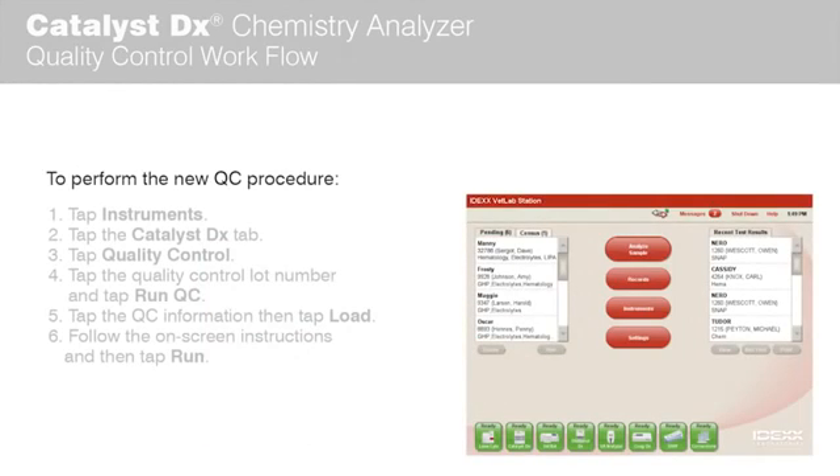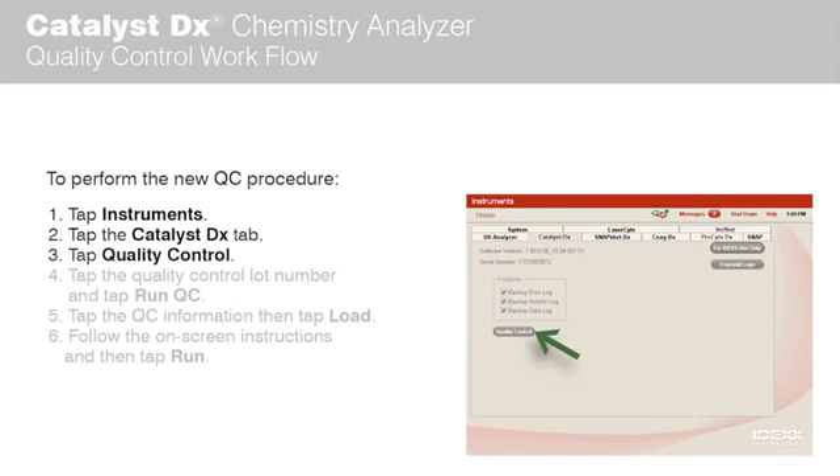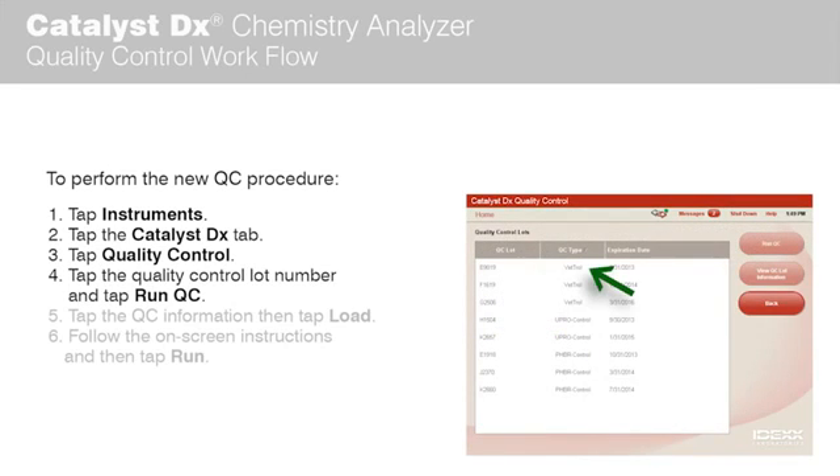To perform the new QC procedure, tap Instruments on the IDEXX VetLab Station home screen. Tap the Catalyst DX Analyzer tab. Tap Quality Control, then tap the Quality Control Lot Number you are using, and tap Run QC.